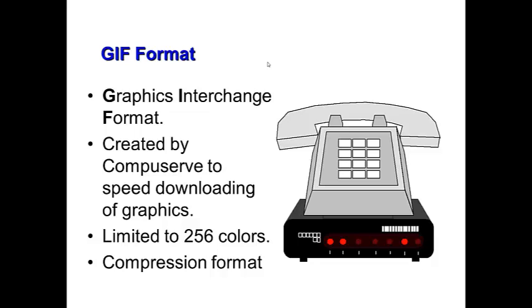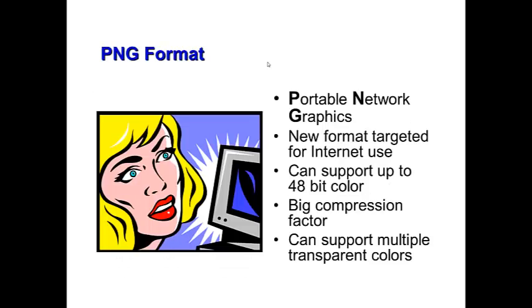It's limited to 256 colors. It also uses a compression scheme inside. Another format is the PNG format. In fact, this is mainly for use on the internet. PNG means Portable Network Graphics. It can support up to 48-bit color. The compression is a little high.